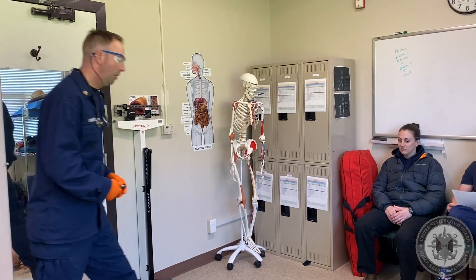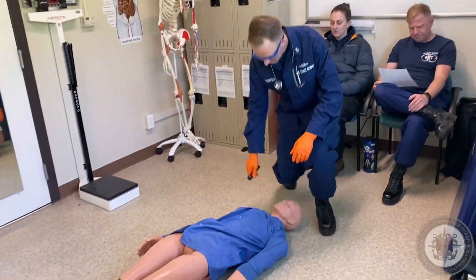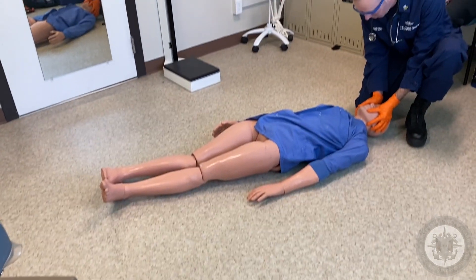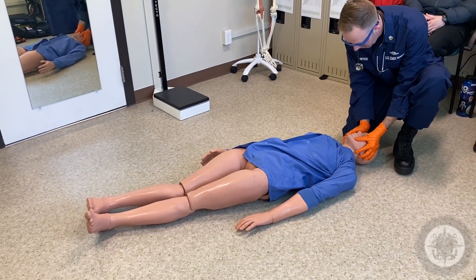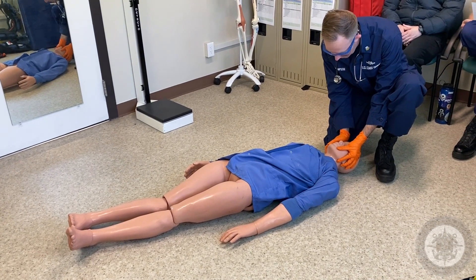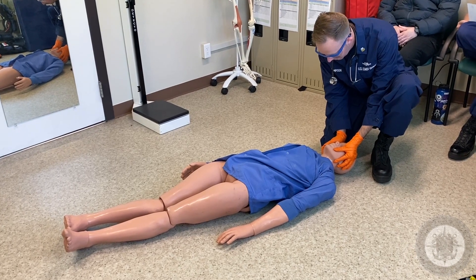I'm going to move into airway. I'm going to perform a jaw thrust maneuver, open the airway, look inside. I'm going to measure an OPA and insert that. Do they accept the OPA? Accepts OPA.